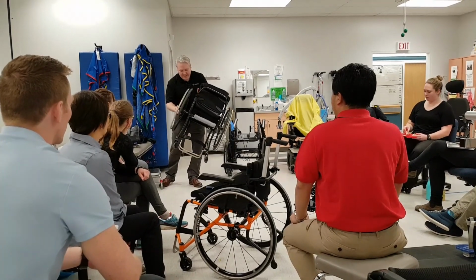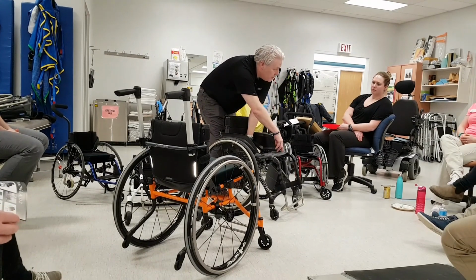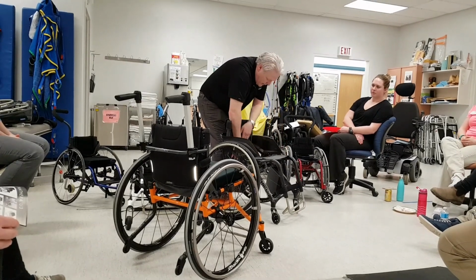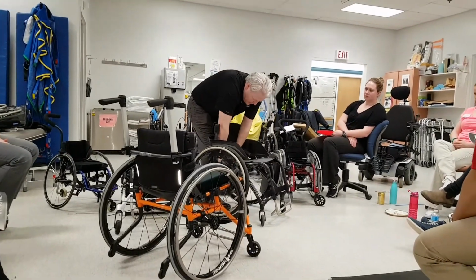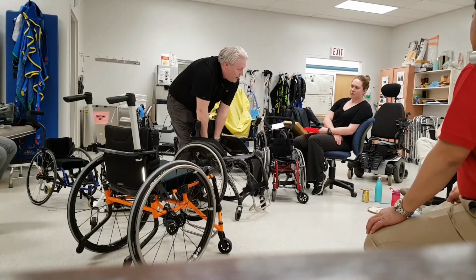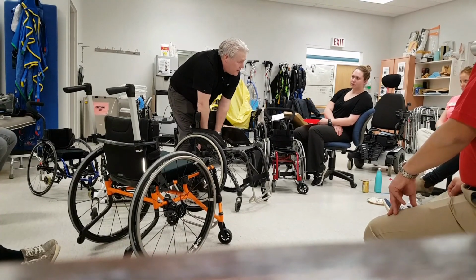When you're looking at this seat base, here it is 14.7 inches, right from here to here. Then I have 4 inches here, and then I have this privacy flap here that can open up. So if you look at that, I can get a lot of depth here, right? Do I always do that with clients? Only when they're tall like that, right?